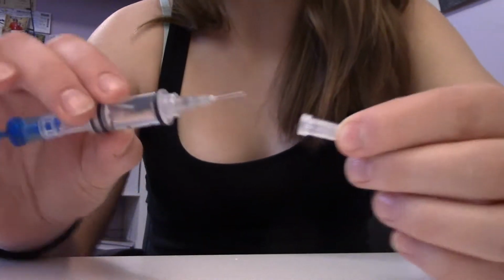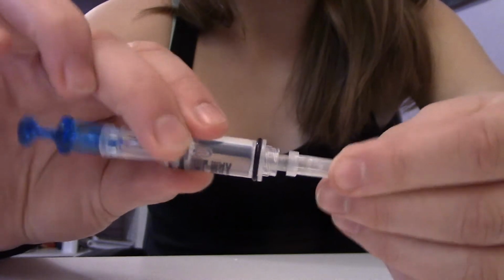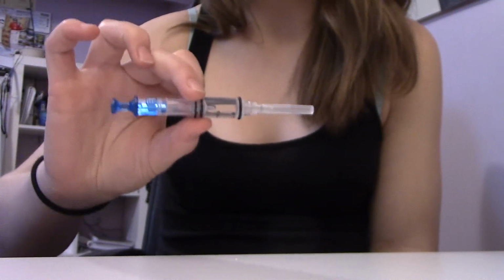And we're going to put the top back on the needle. It is a pretty long needle, as you can see, so be careful not to stab yourself with it. And then we're just going to take this and put it off to the side for right now.